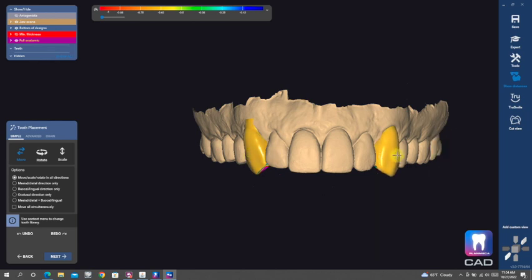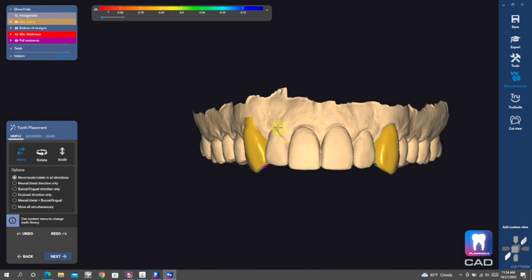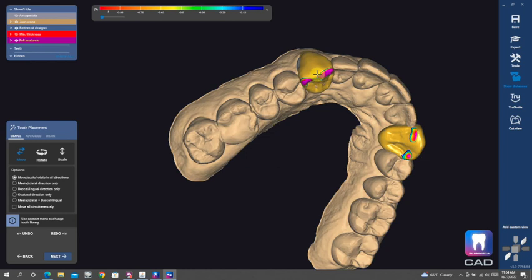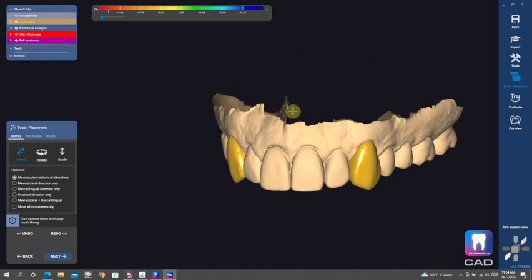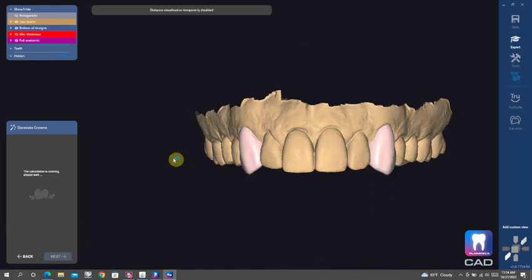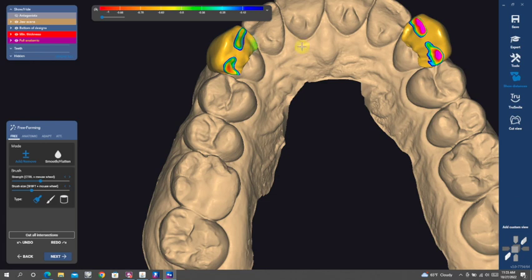And then as you see, we're going in. You can use whatever tooth library you want. I just use the default for me, which is HD. And basically, we're going to go in and do a really simple elongated canine design.